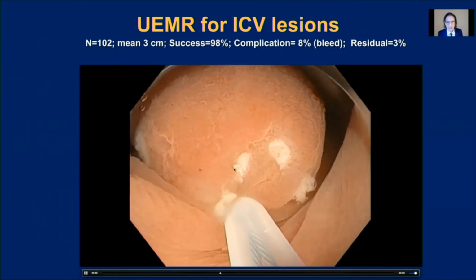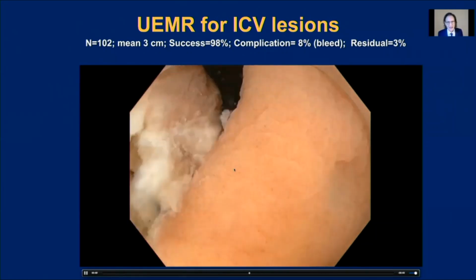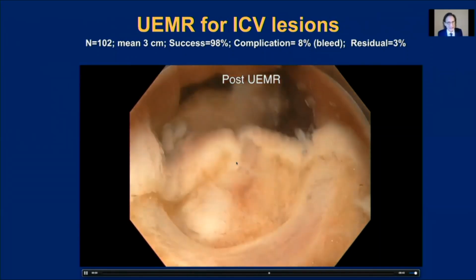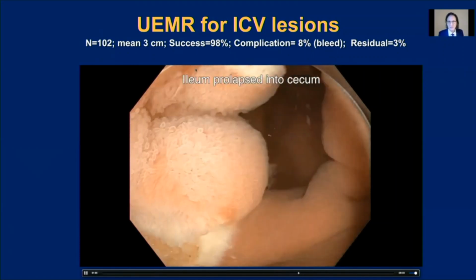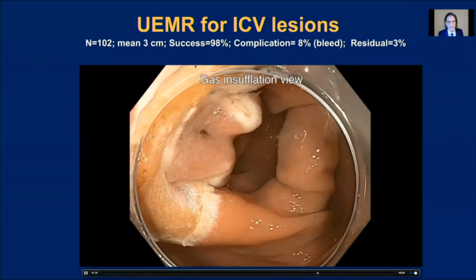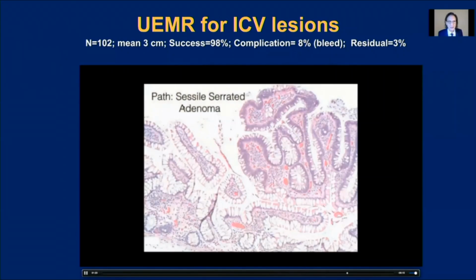So we close the snare, it turns a little violaceous, and you see the snare is around the dots, and then we apply our current and cut it through. Now the fat tissue is often very vascular, so it's not uncommon to get bleeding here. We sometimes do need to coagulate these small vessels. But you can see after the resection, the ileum prolapses into the cecum because we've removed that part of the valve. So not the valve itself, but that mucosal and submucosal portion. And this was a sessile serrated adenoma on pathology.